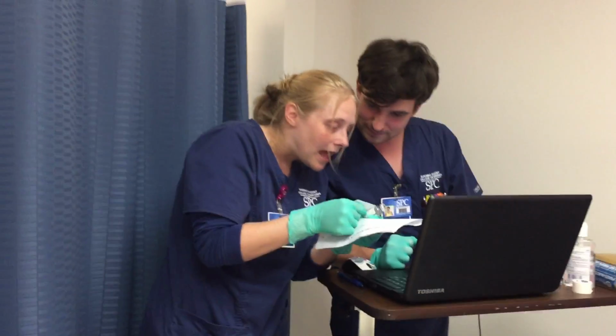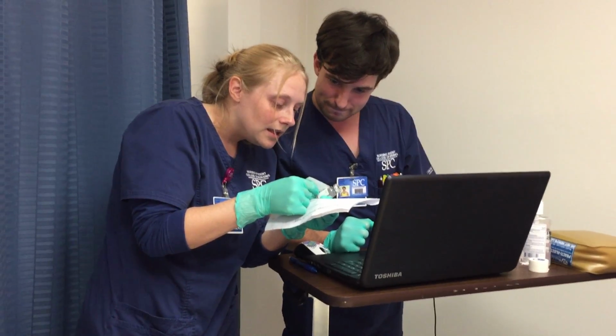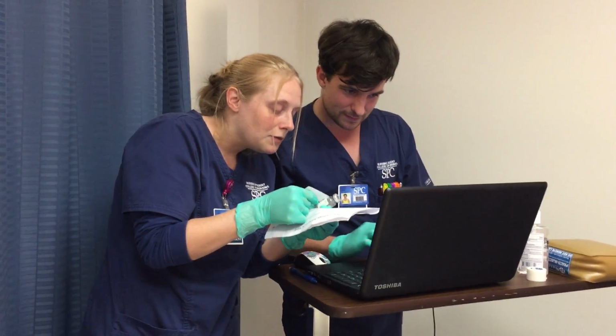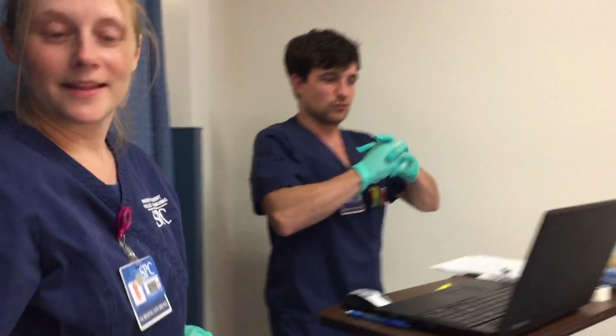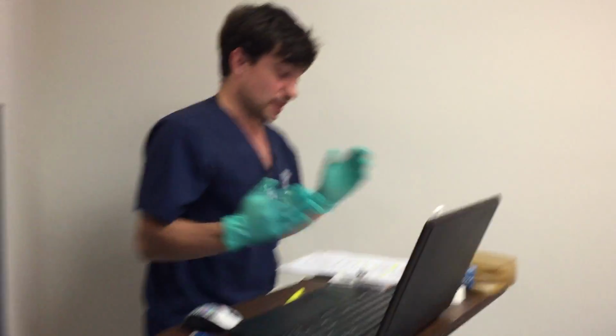Uh-oh. D9 BC 98 EB 983651. Ah, wonderful. A green light, which means it's a go. So now I can start drawing up the med.